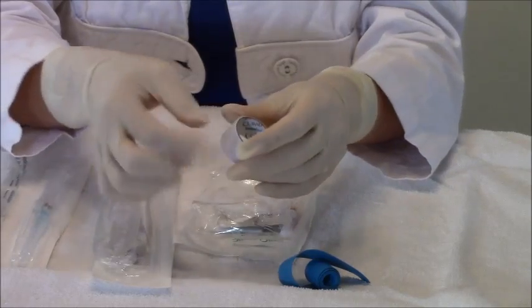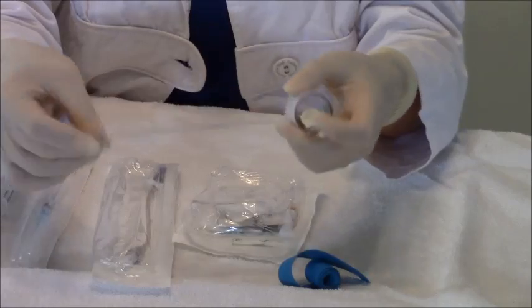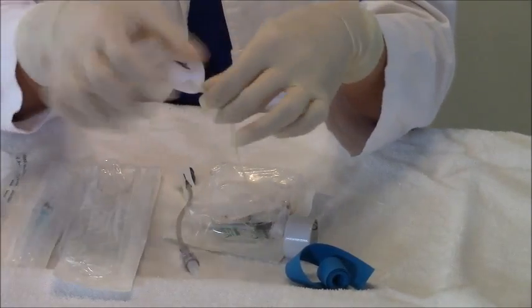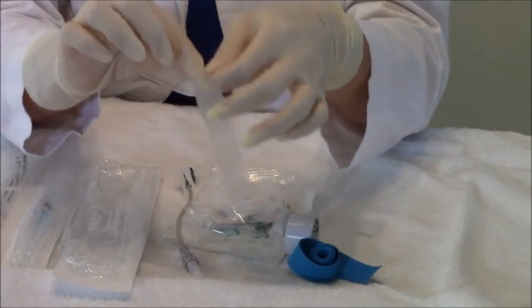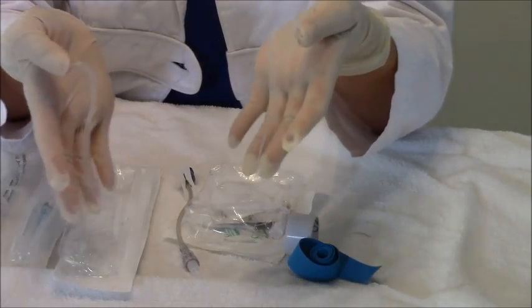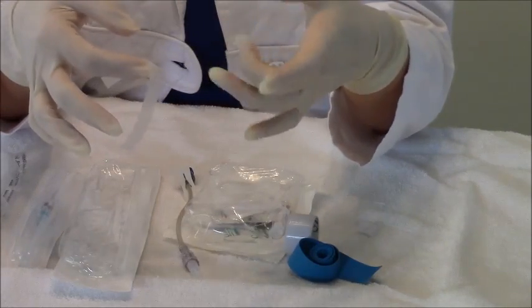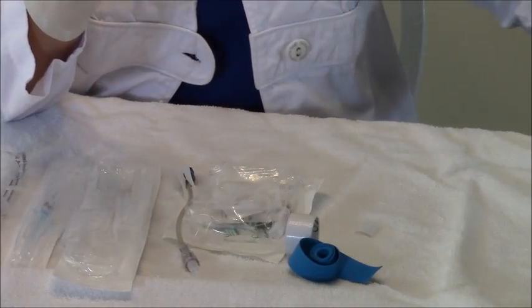What I normally do is pull back the tape backing and peel off several inches, long enough to secure around the IV. I take that off and take the other end off as well. I like to cut or tear it in half because I take each piece of tape and tie it around the IV cannula part, which I'll show you a little bit later. In the meanwhile, I just stick it beside me so after I get the IV I can tape it down really fast.